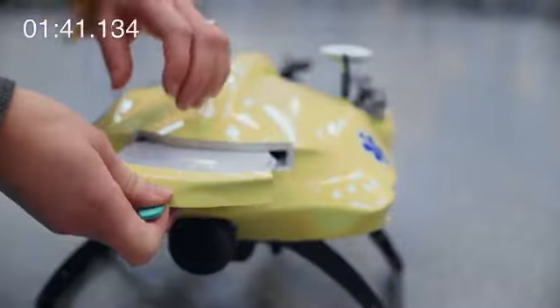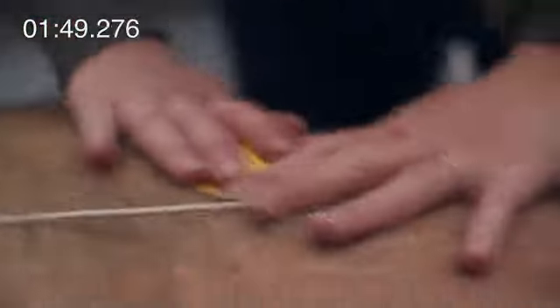Okay, pull the green lid. Now place the pads on your father's chest. Good, I can see that the pads are properly applied. Joanna, please stay clear of your father. We'll take it from here.